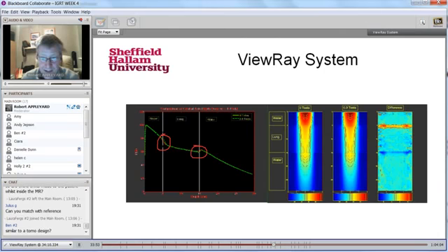There and there. You can see there that you don't get the same degree of electron return effect as you do with the high field strength.